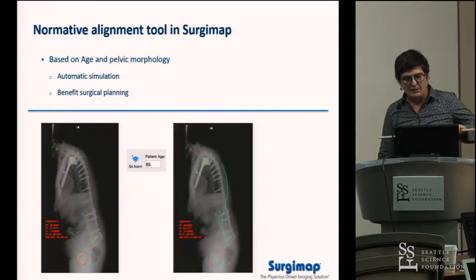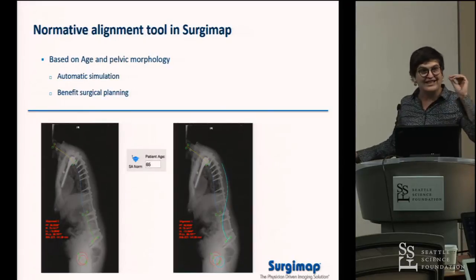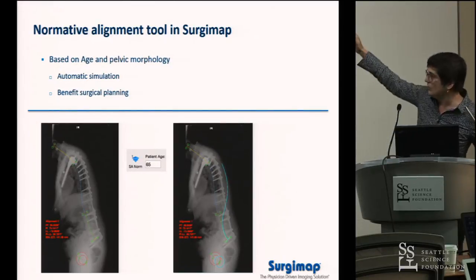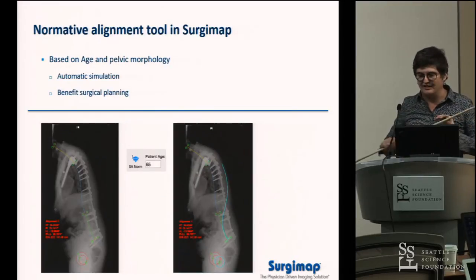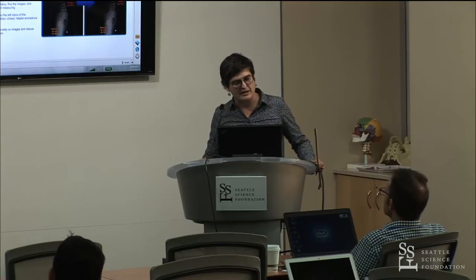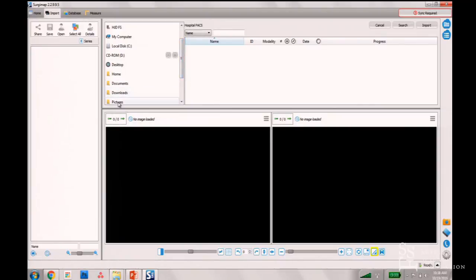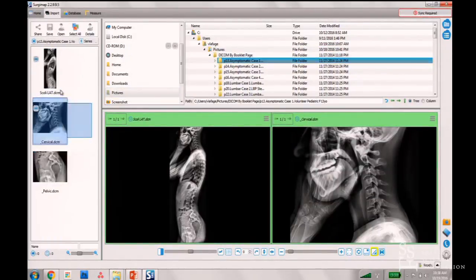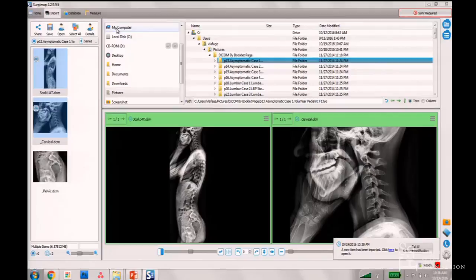In the software, you can have age-adjusted guides. You do the basic measurement, and the software grabs the patient's age from the DICOM and gives you a guideline in terms of alignment. Let me switch directly to the software. Like any software, you first import your image. Once you have an X-ray, you select it, it saves, and the DICOM automatically organizes everything in the database. You can retrieve images from your PAC system.